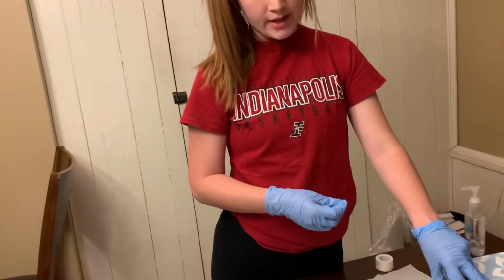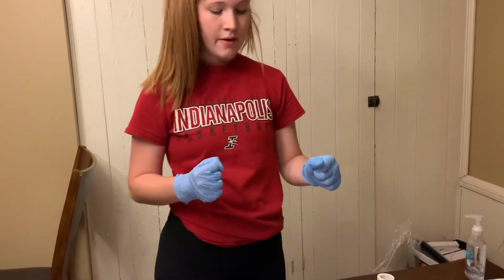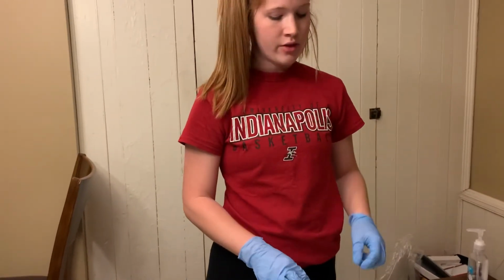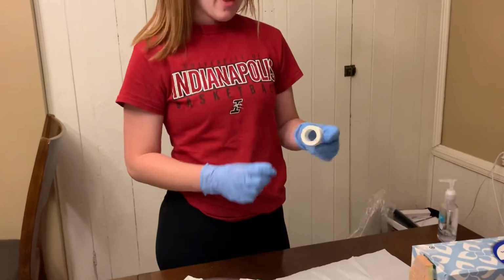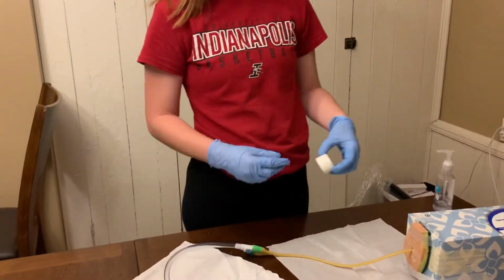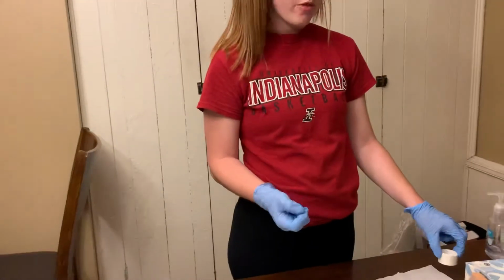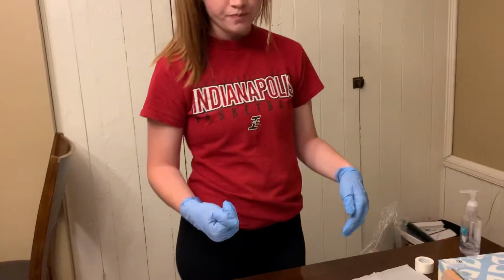Now that that is in place, I would then tape my catheter in place. In the clinical setting, I would take the catheter tubing, take a little slack, and I would use the tape that I have here to tape it into place on the patient's inner thigh because it's a female patient. For the purposes today, I'm just going to verbalize that as I don't have anything good to tape it to.